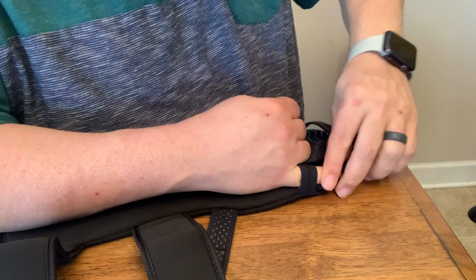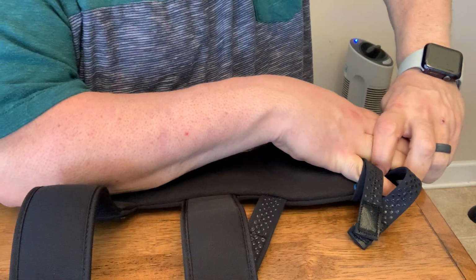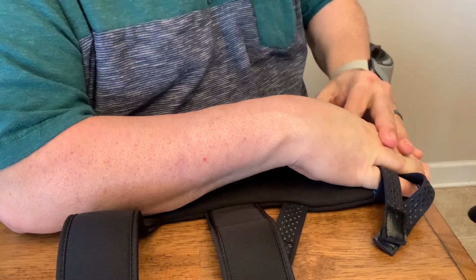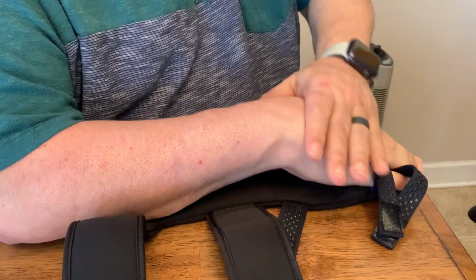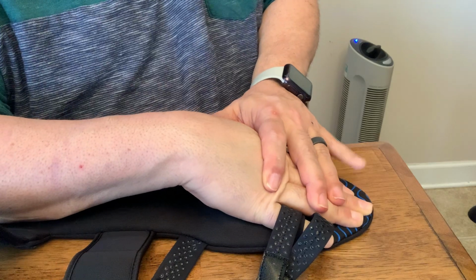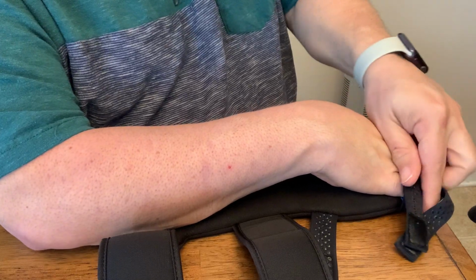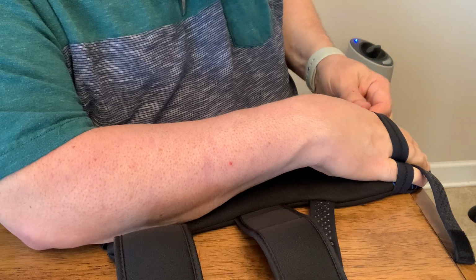Straighten your pinky out. Now you've got your other three fingers that are going to fight me. So you go to the edge of the table and press down hard. Don't worry about your thumb right now. Well, you can just put your thumb here to kind of prop it. So press down, flatten your hand, make sure your middle finger's touching the top of the pad, okay? And you can see I can stretch a little bit. And then you apply these two straps, which hold your knuckles down.